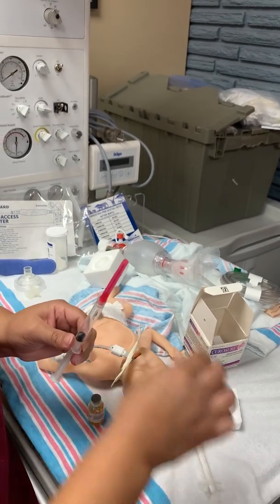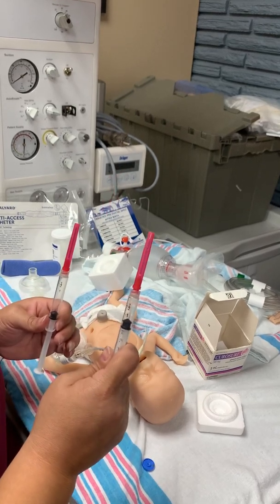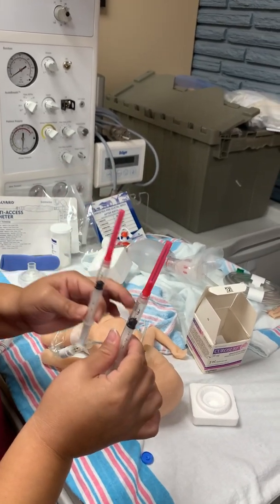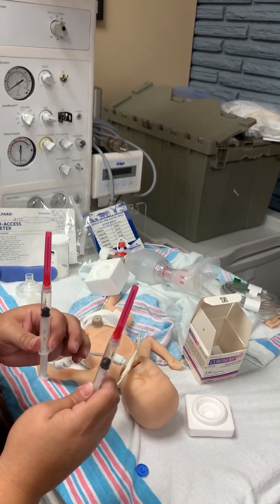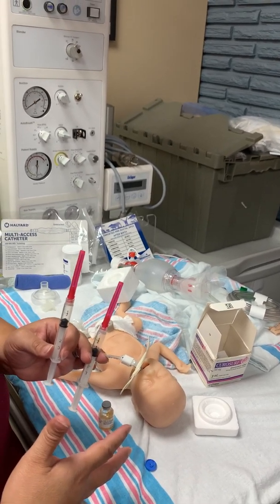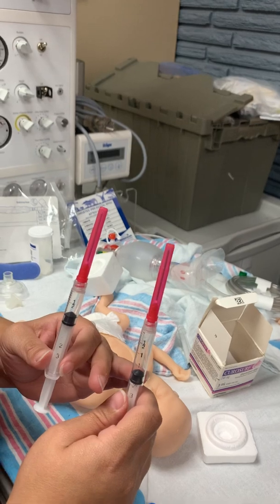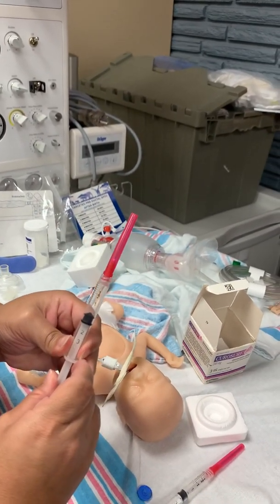So what I'm gonna do is I'm gonna transfer it to a second syringe. So we're gonna have 1.25 in one syringe and 1.25 in the second syringe, okay? So now what we wanna do is have an extra air bolus after the fact, because we wanna be able to give the patient the entire dose of surfactant, and some may be kept in the catheter. So we just wanna set them up for success, give them about another half ml of air or 1 ml of air. So we did that here.